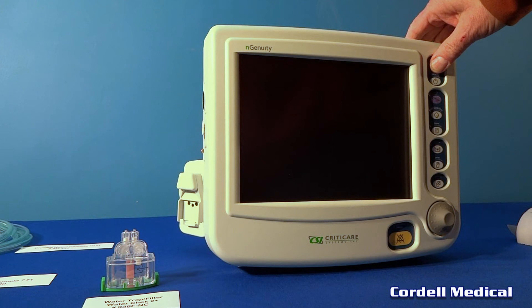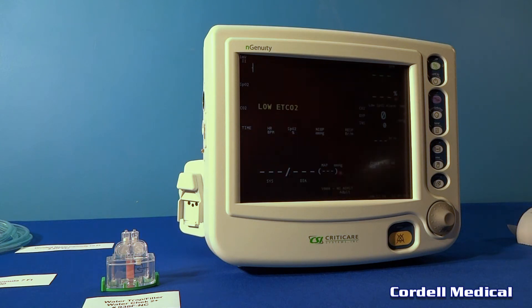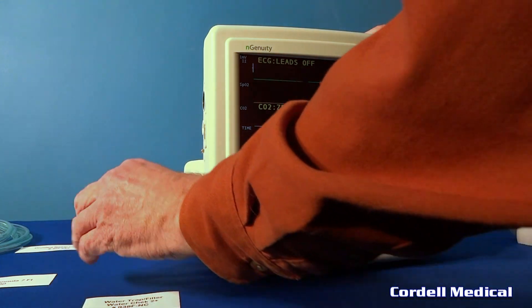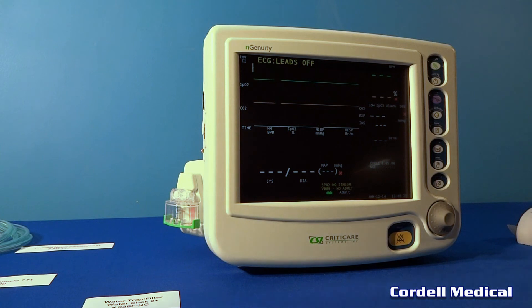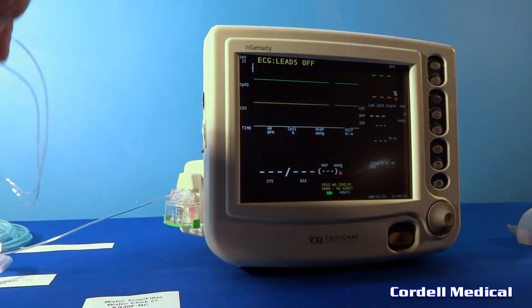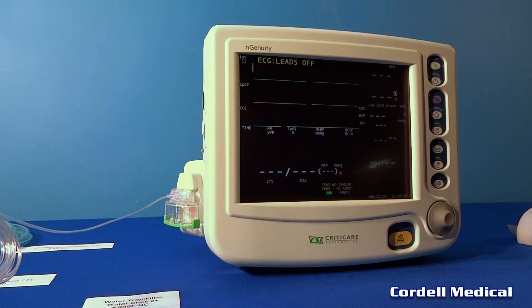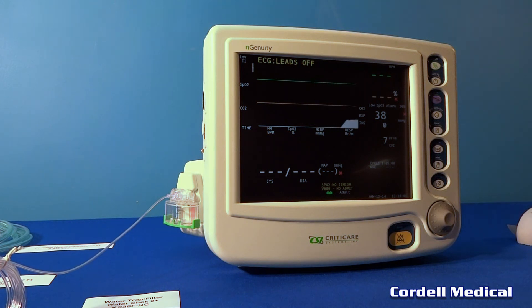We're going to go ahead and turn the monitor on. Again, it'll go through its CO2 calibration — the zero cal appears for about five seconds and then goes into about 10 seconds of calibration. We'll set the water trap in place and insert a nasal cannula. Just insert it straight into the water trap and turn it to the right. I'll go ahead and start breathing into the nasal cannula — it just takes a few moments and it starts to pick up. It's noticing I'm breathing into it, so it does a calibration for about 10 seconds, then starts measuring End-Tidal CO2.